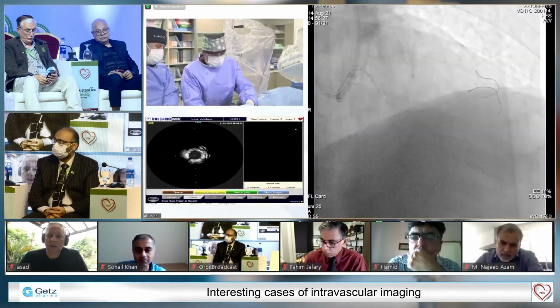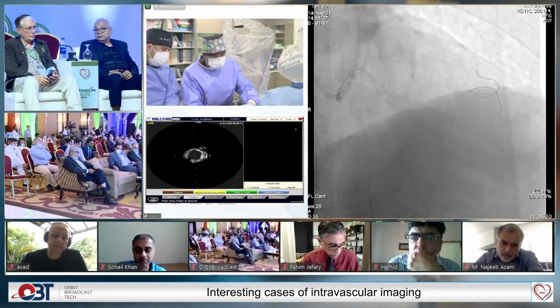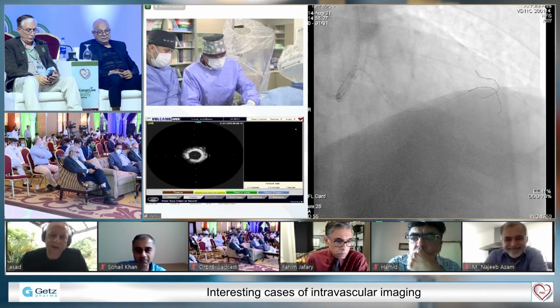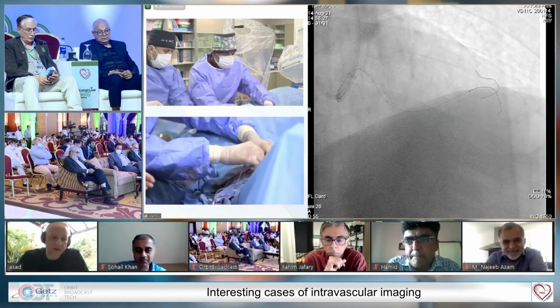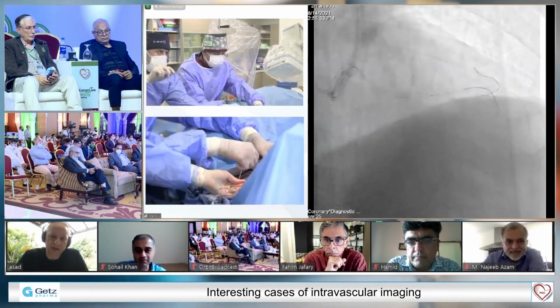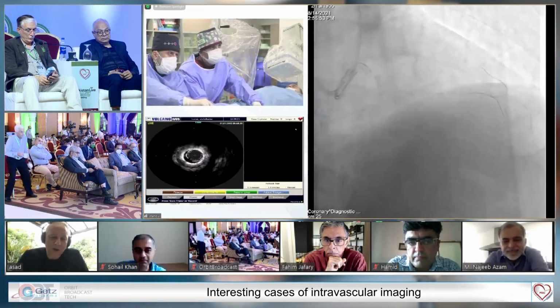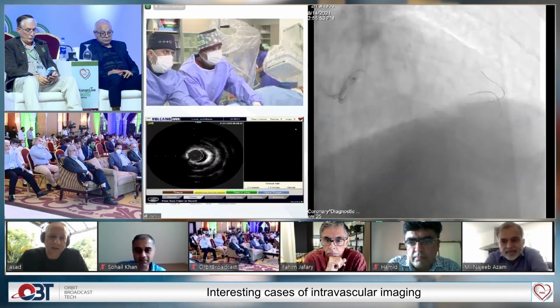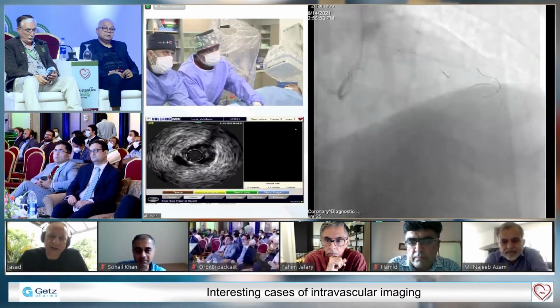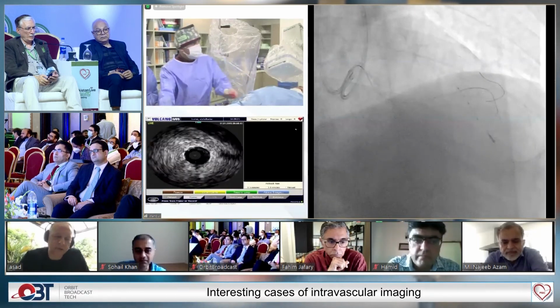IVUS will be in the small place. So, what do you want to do? Do you want to put the proximal stent first or the distal stent? I think I would personally prefer to put in the distal stent first, just so that I don't have trouble going through this previous stent. Although in your hands, I think you'll be able to do it either way. One advantage would be that you won't extend your dissections, and you might have a better idea of it, and perhaps avoid too much stenting if you start with the proximal.